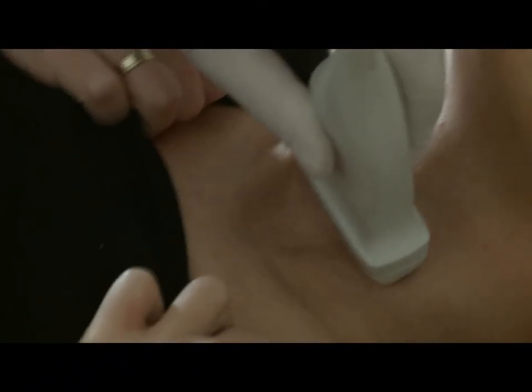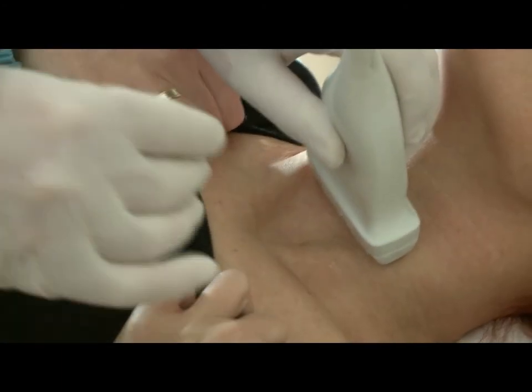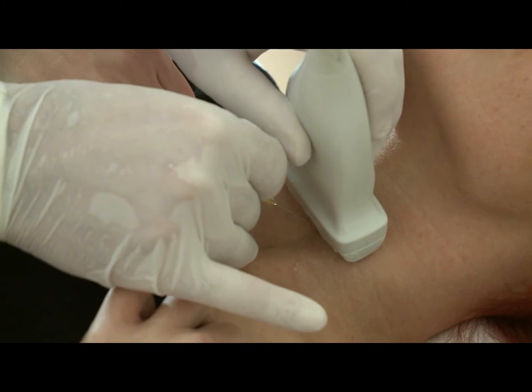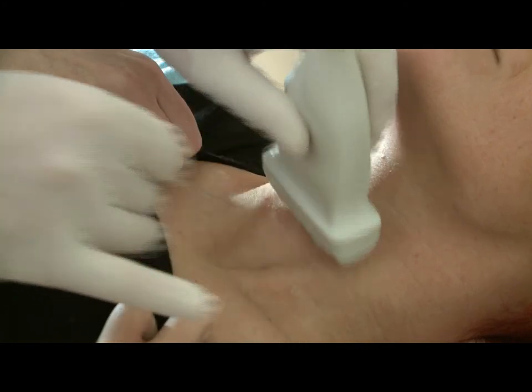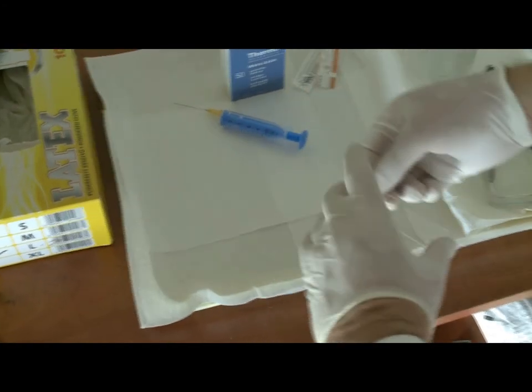Let's see how to perform non-aspiration sampling. First, we search for the adequate position. Thereafter, we insert a needle. When you have reached the nodule, move the needle in it several times, also helping to get as much material from the nodule as possible into the needle. Then we put the needle into a syringe and perform the usual phases of smear preparation.